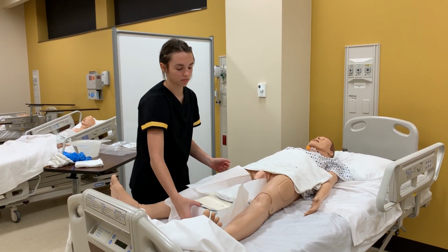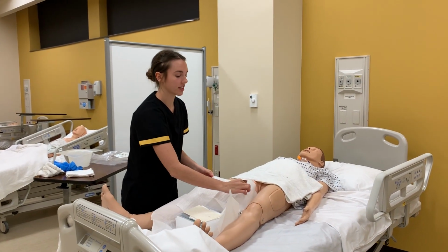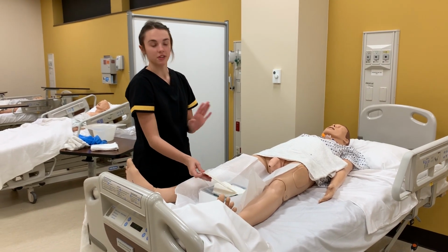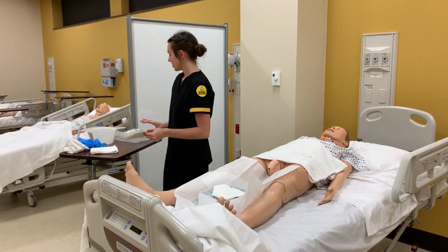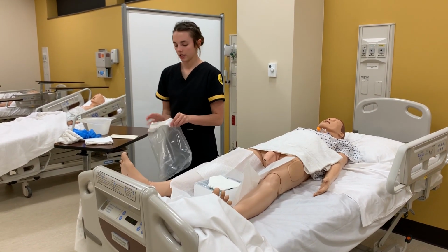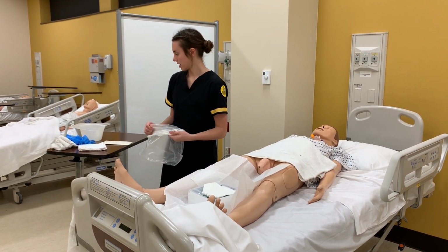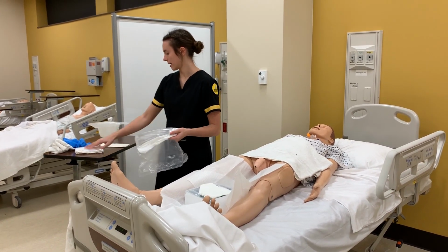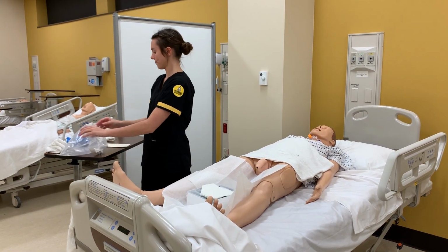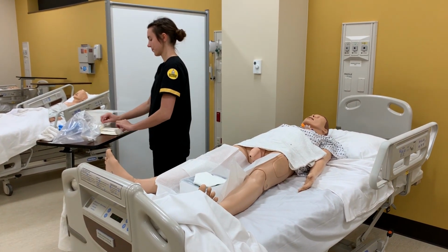Here, let me move my tray. And if at any time in this procedure in real life I broke sterile field like we just did, we would have to start over. But for the video, we're good. So before I put on my sterile gloves, I'm going to make us a little garbage bag so we can discard any of the things that we're about to use. There we go. So we put on my sterile gloves and we can get started.